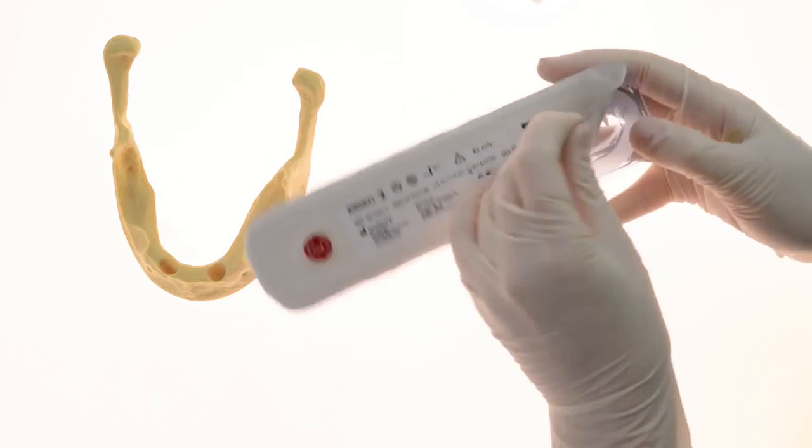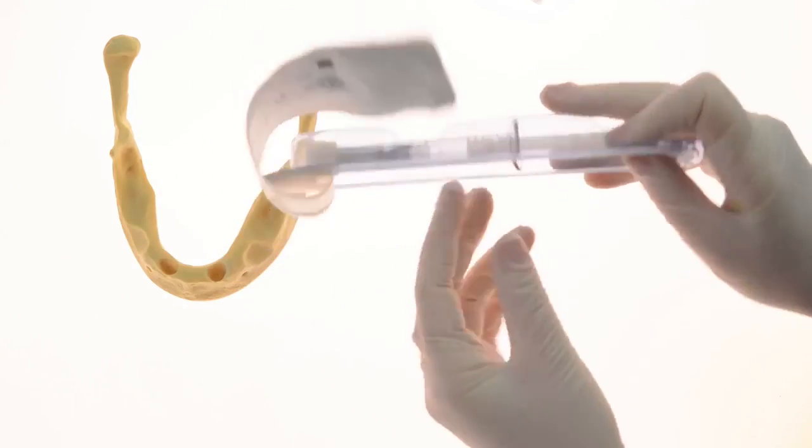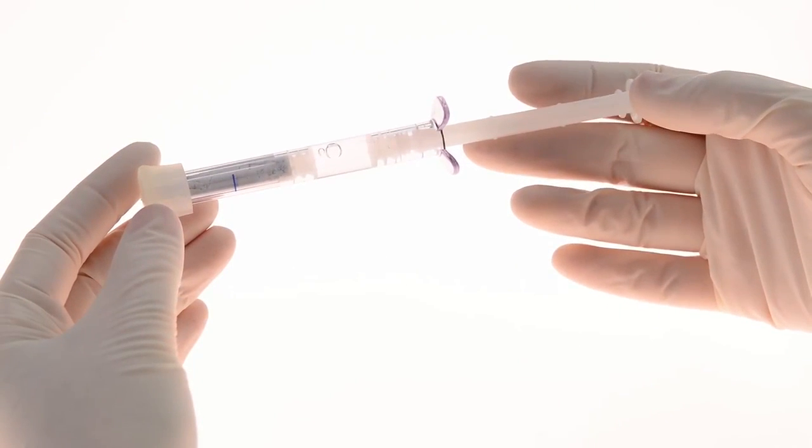After removing the syringe from its packaging, flick the driver gently a few times prior to mixing the liquid and solid portions of the Formatrix. This will ensure that complete saturation is achieved.